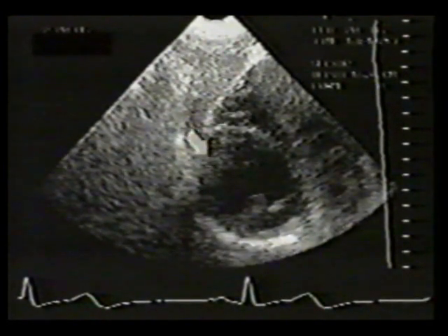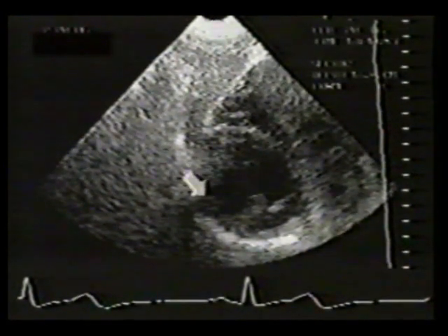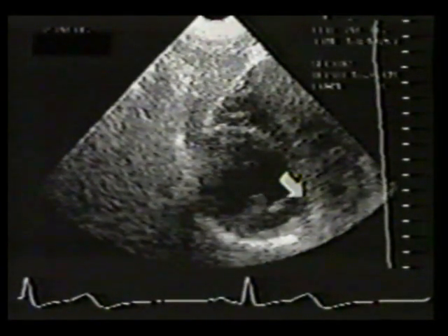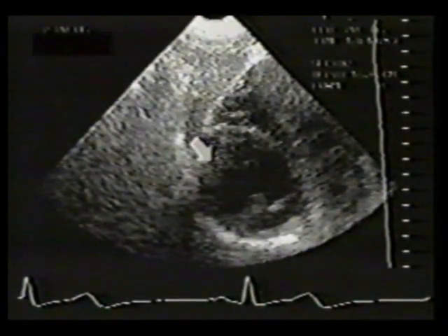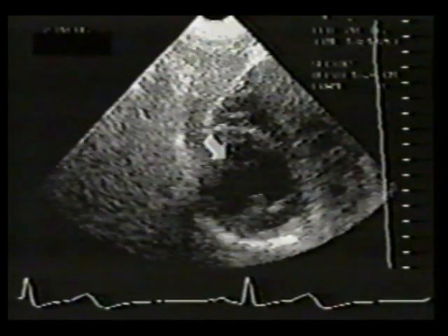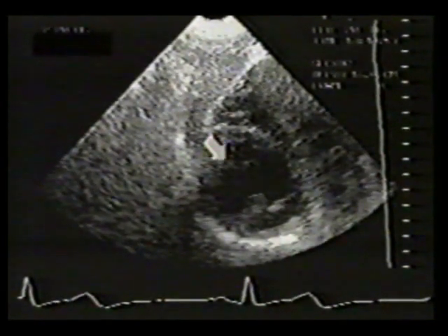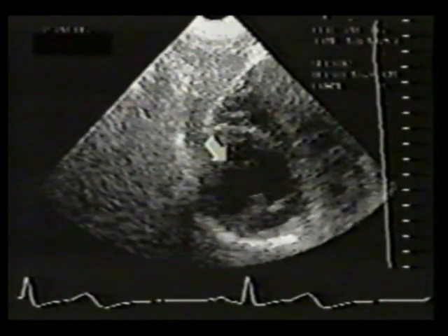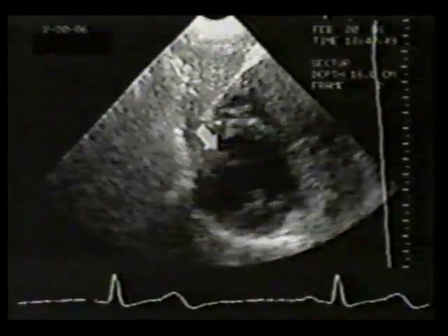This is the inferior wall of the left ventricle, this is the lateral wall, and this is the anterior wall. The inferior wall of the left ventricle and the posteromedial papillary muscle are often partially obscured in this view. This means that this view is less reliable than the peristernal short axis view for the diagnosis of inferior infarctions.